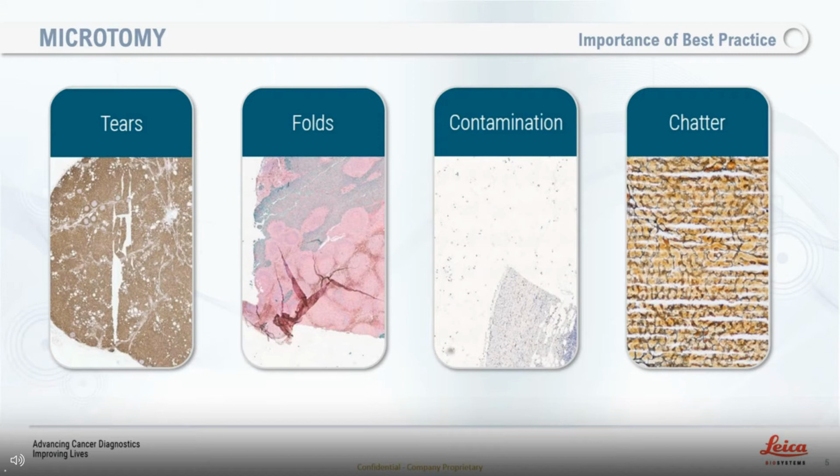However, when you utilize digital pathology, depending on the type of scanner that you're using, this can cause the focusing to jump out of focus, where in that white space it's trying to detect tissue, and maybe it'll detect a fragment that's at a different level in the microtopography and then cause some out of focus region.